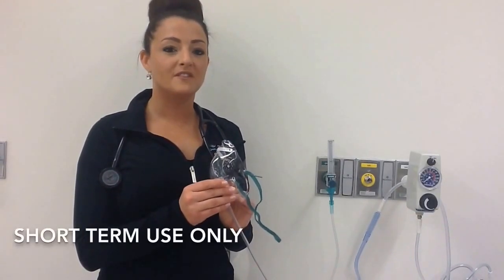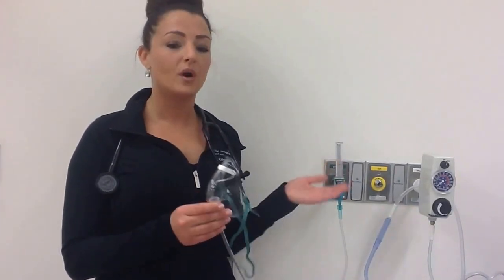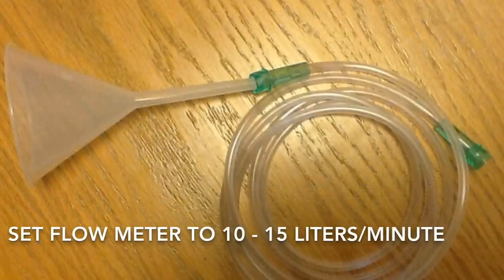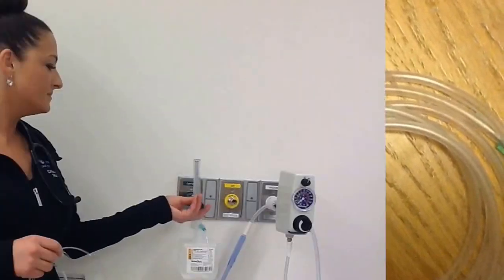This is a short-term device because there's no humidification. It may be used for things like transport, post-anesthesia, or at the bedside as a standby oxygen delivery device. Speaking of standby oxygen, in some areas of this hospital, you may see a funnel used. The liter flow must be set at 10 to 15 liters, and the FiO2 is variable.